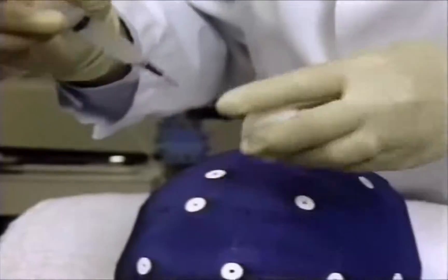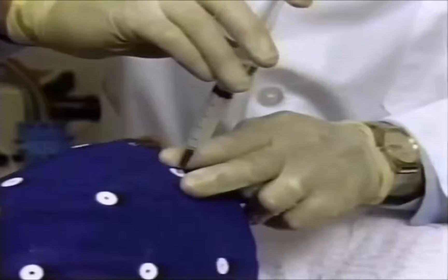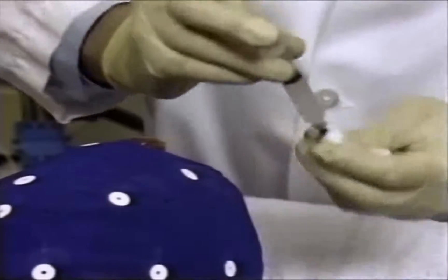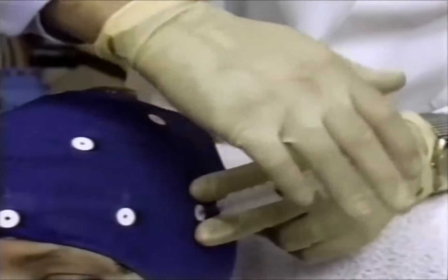Remember that light fingertip pressure is all that is needed to abrade the skin and obtain proper electrode resistance. Too much pressure may cause the scalp to bleed, which can result in persistent artifacts throughout the test.